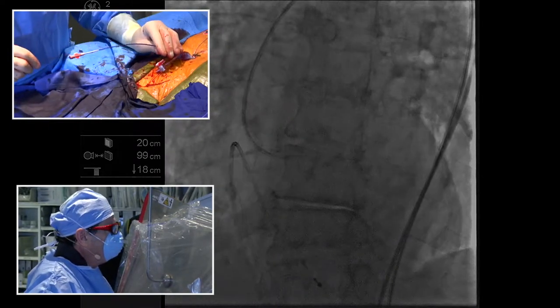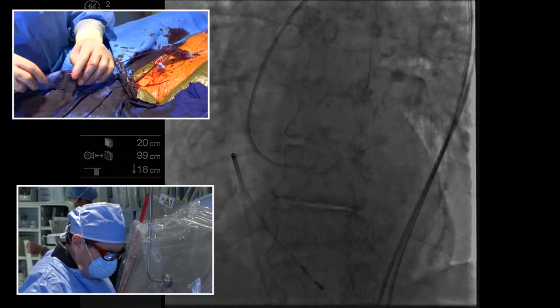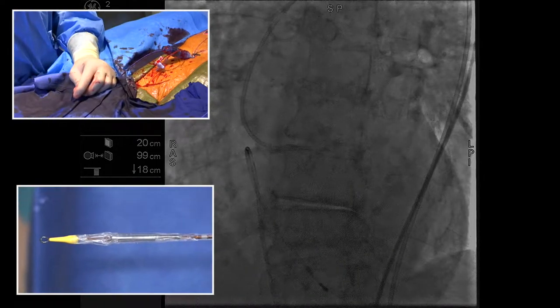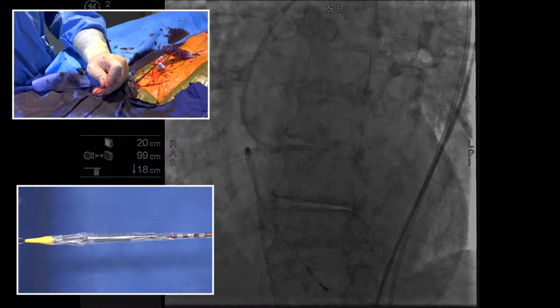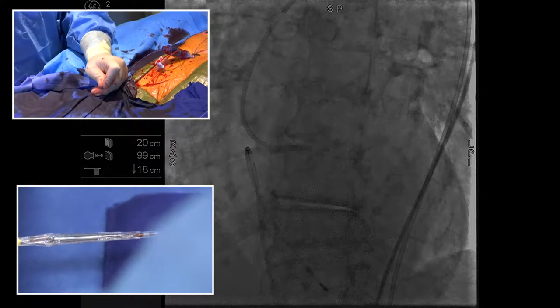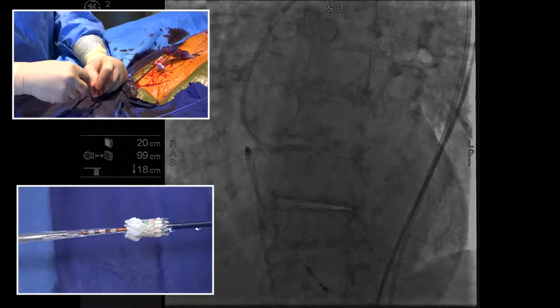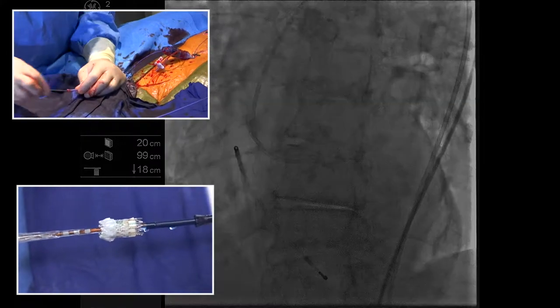All right, let's get the JR, so we need a wire. Let's just put a wire in here. We can. You got a stiff wire or something like that? Sorry, guys, I don't mean to be boring y'all. No, it's not boring. This is good to see. It's not always... this is a little bit of a struggle.